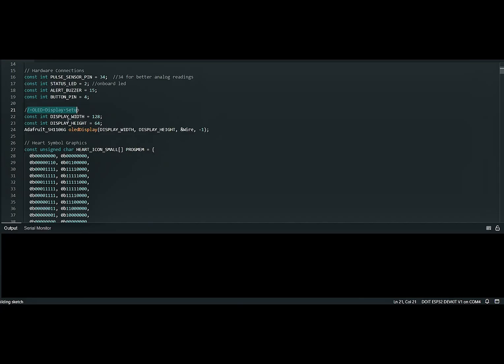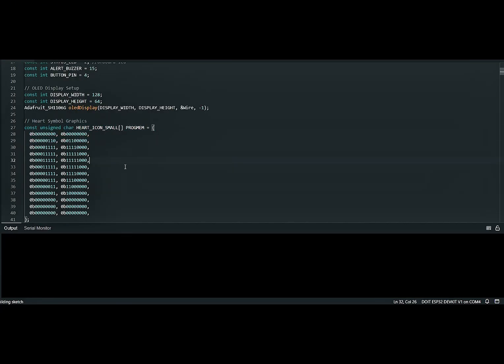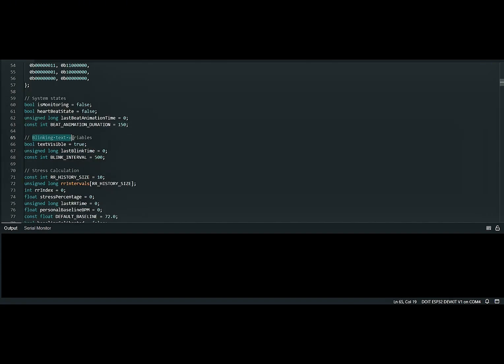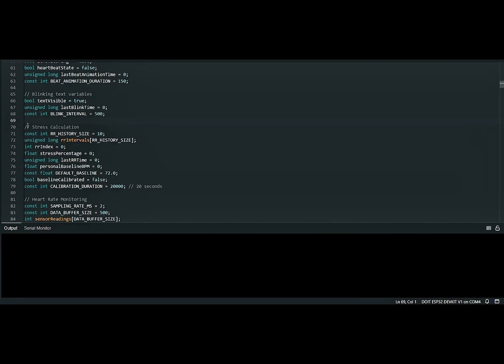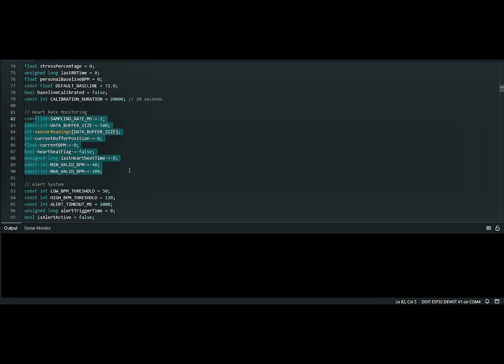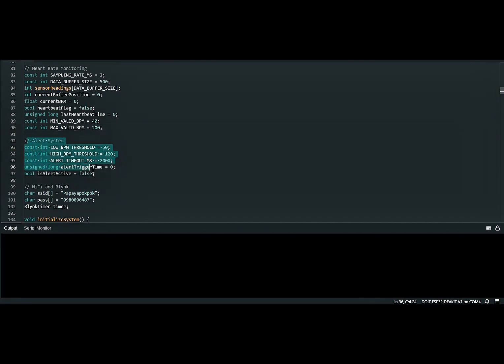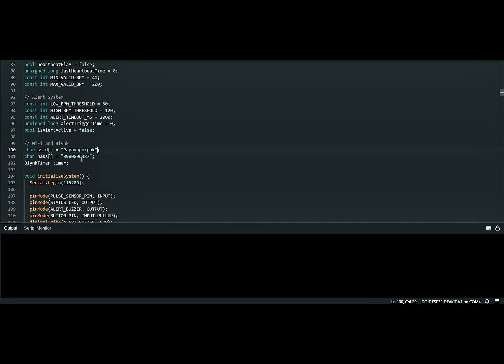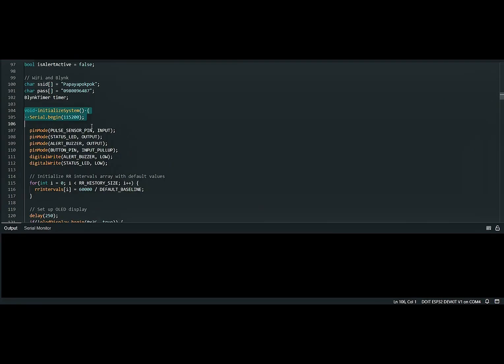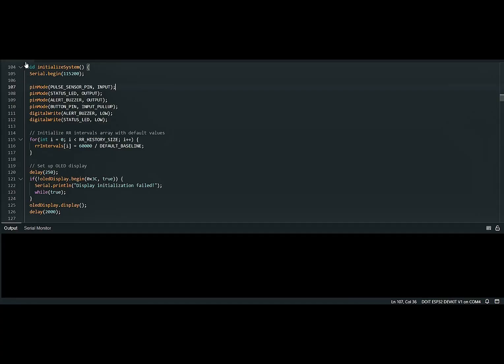Next is the OLED display setup and the heart symbol. Next is the part of system state, blinking text variables, or the variables that I use for the functions. This part is the Wi-Fi and password that I use to connect Blynk to the ESP32. Next part is void initialize system. So I will use this function in the void setup. It will run first and one time.